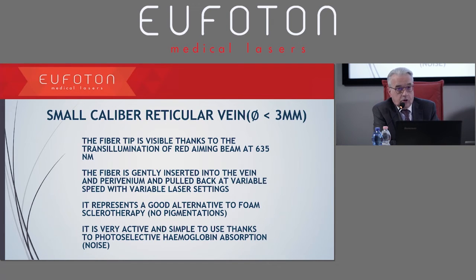The fiber is introduced naked, without the cannula or the needle, in the reticular vein, and the insertion brings this energy directly in contact with the vein and with the blood.